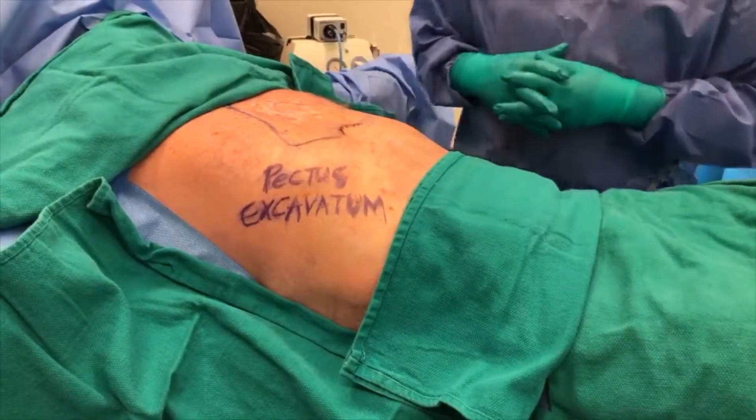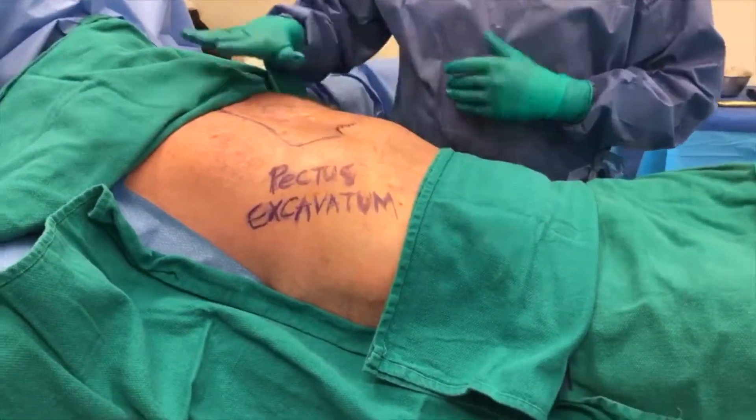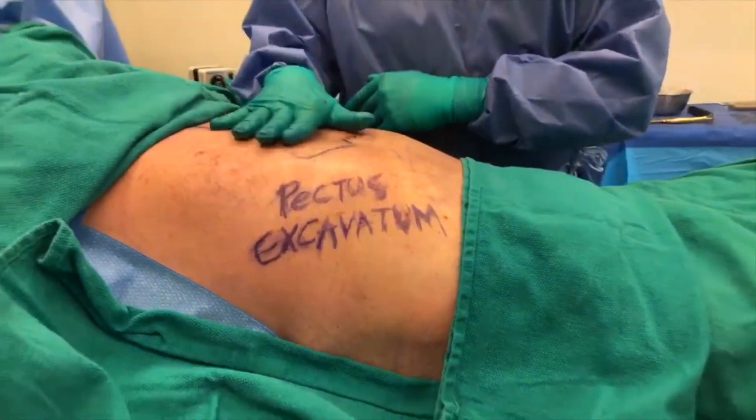Hello, welcome back. This is Dr. Dupere at the Visage Clinic. This is the same gentleman. We did a pectus excavatum correction — you've seen, a few hours ago, me putting a custom-made implant into the mid-chest.